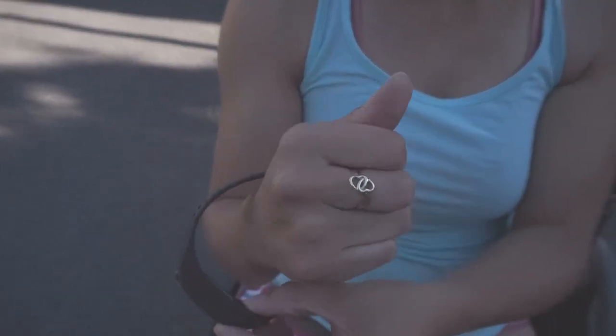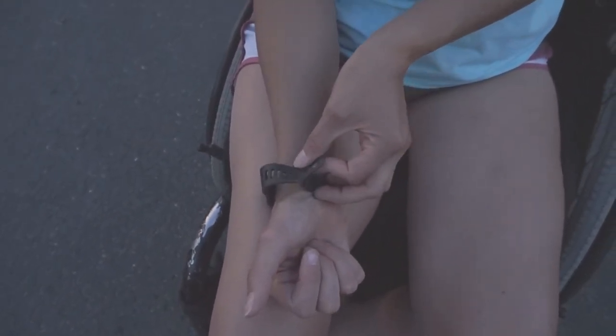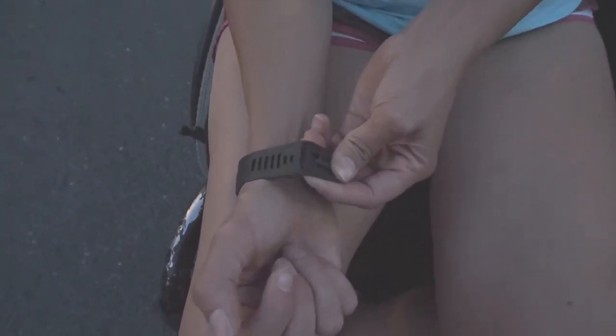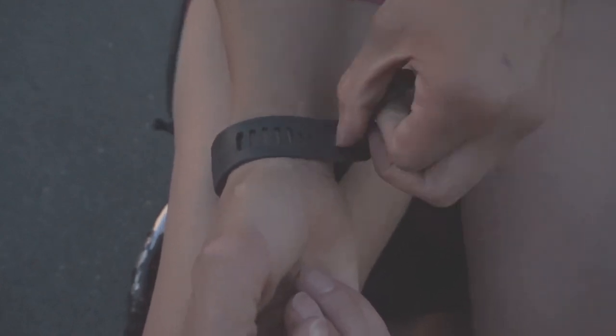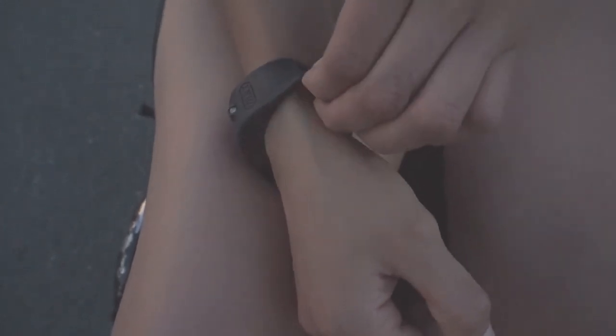What I don't like about this one is it's one of the hardest things to put on by yourself. You've got to get this through that — and this strap doesn't have any settings.